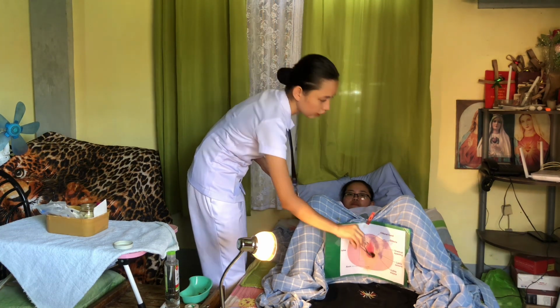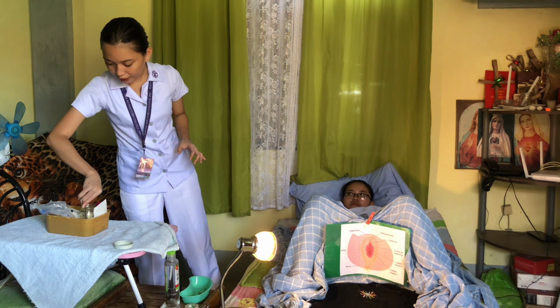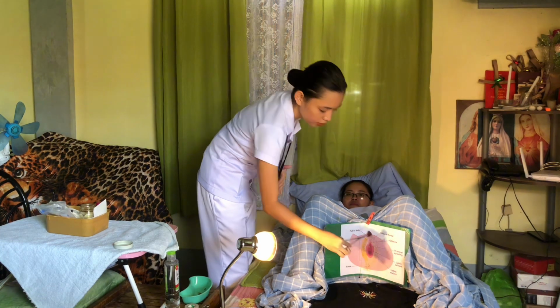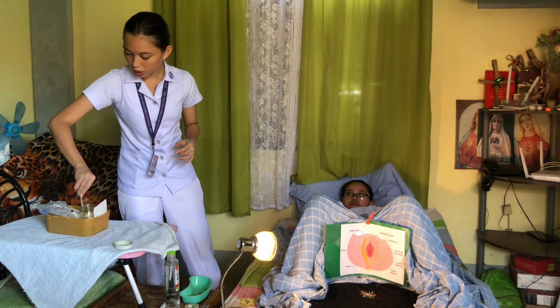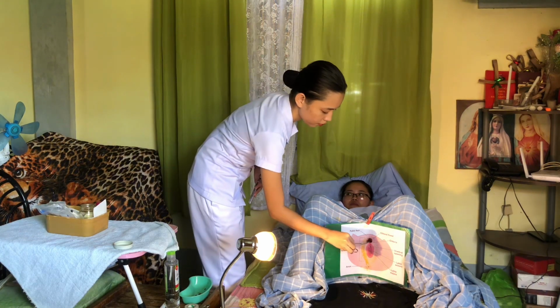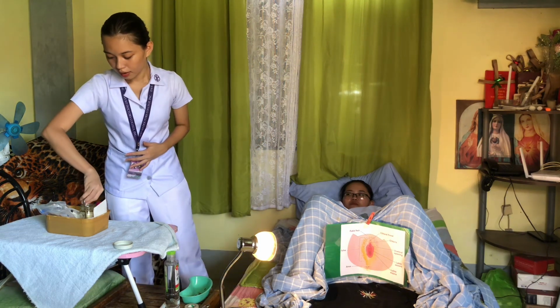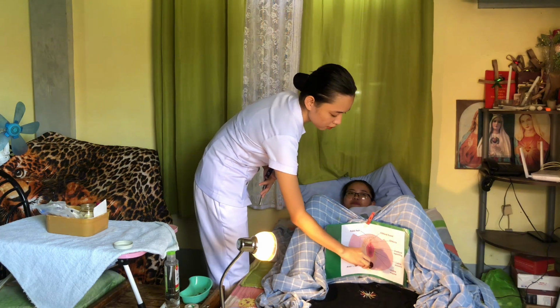Remember that we should never replace or retrace a stroke, to ensure that we do not contaminate the cleansed area. And now let's proceed on the opposite side using a different cotton ball. Now, with another cotton ball, let's do the labia minora. And with another cotton ball, the other side. And then discard.